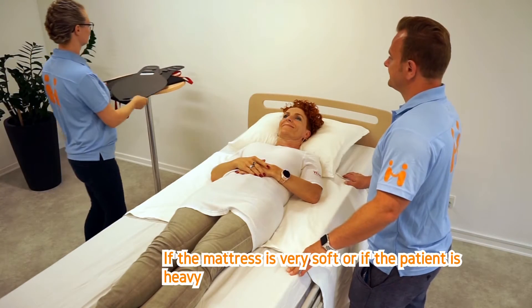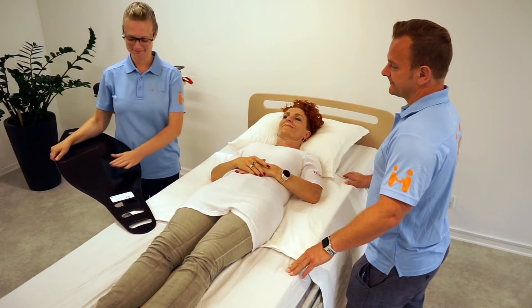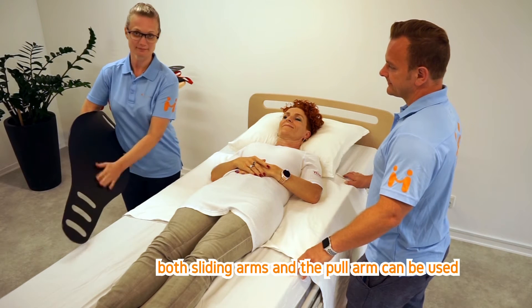If the mattress is very soft or the patient is heavy, both sliding arms and the pull arm can be used.